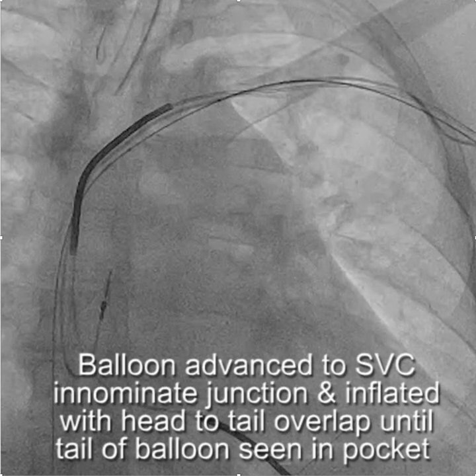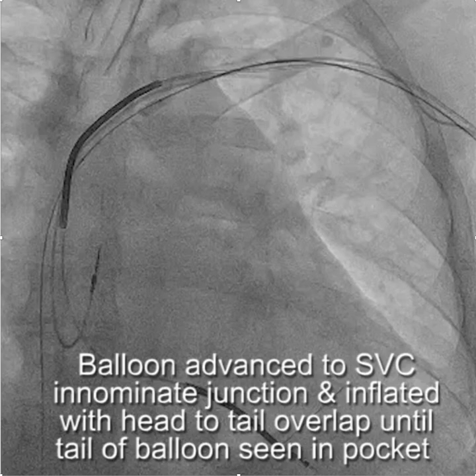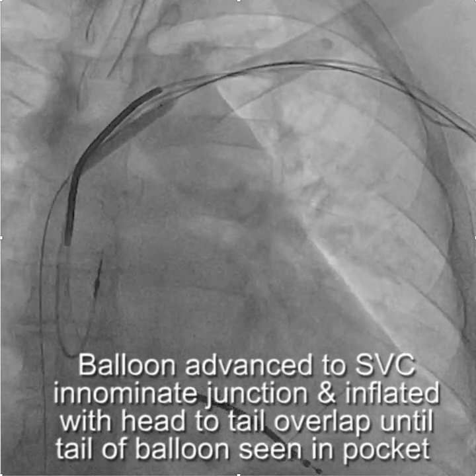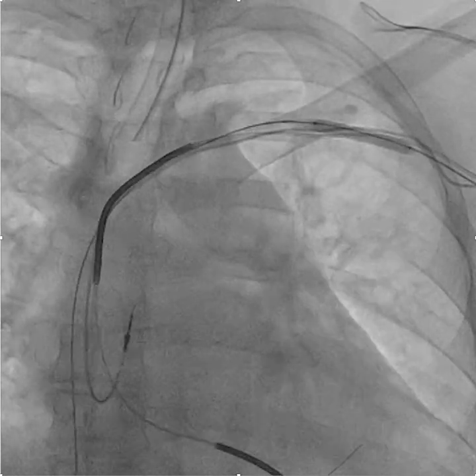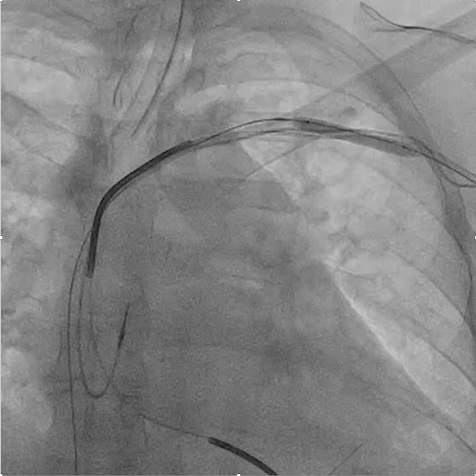You can give it a push there — if this were just a glide wire, you may not have enough support to advance the balloon. This is actually an older case, so we're still using the six millimeter balloon here; we've pretty much gone to nine millimeter as our standard balloon. You do your first inflation at the innominate-SVC junction, then do a head-to-tail overlap until you see the tail of the balloon in the pocket. It's really important that you do that last inflation — although it does cause some anxiety, patients don't bleed to death, I promise you.